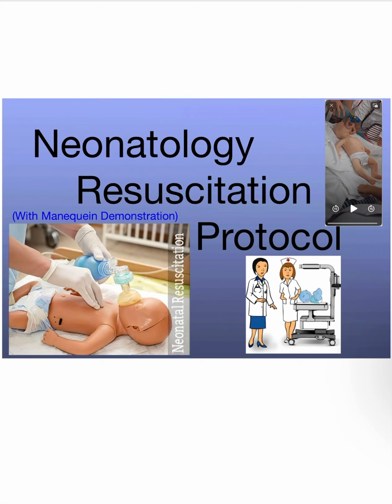If you see the photo, in the picture you can see a mask being applied on the baby, on the mannequin, and this is the neonatal warmer on which the baby is kept post delivery. Why? Because they need adequate temperature. What is the normal temperature of the newborn? If you can recall, it's 36.5 to 37.5 degrees. And this is the video mannequin demonstration that I'll play after we are done with the theory.